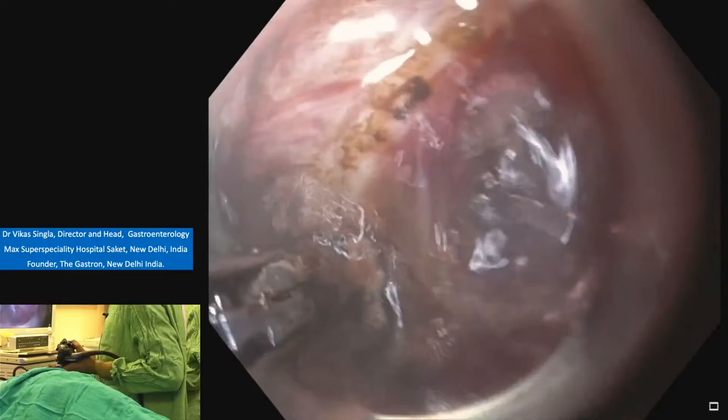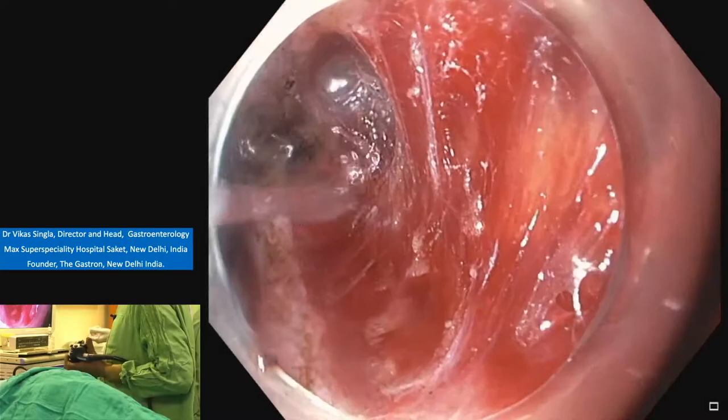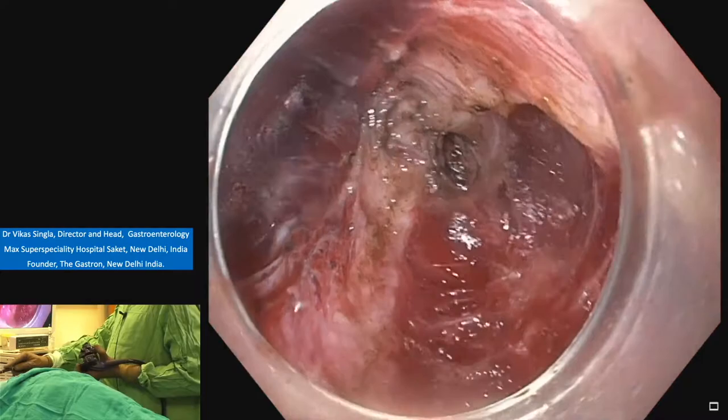Open. Clean that area and target the vessel in a proper manner. I think we have completed the myotomy.